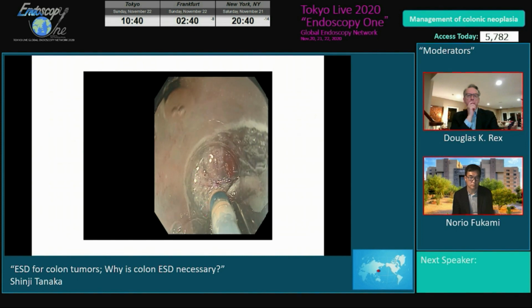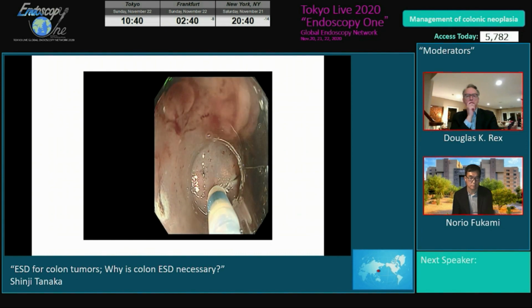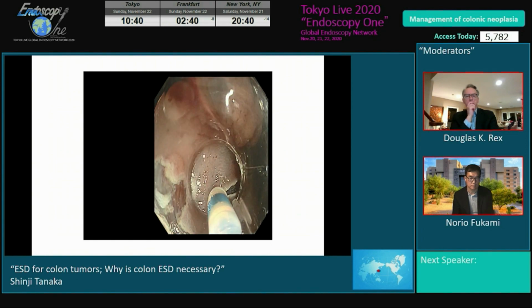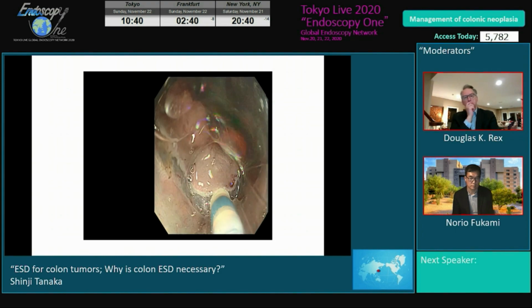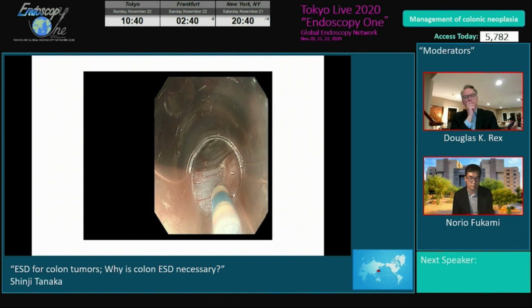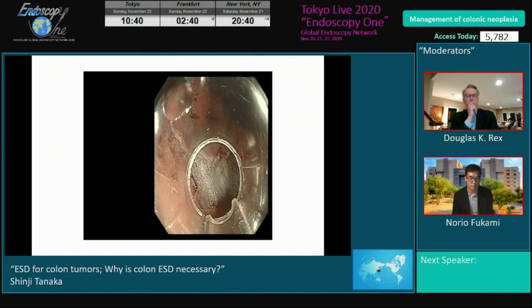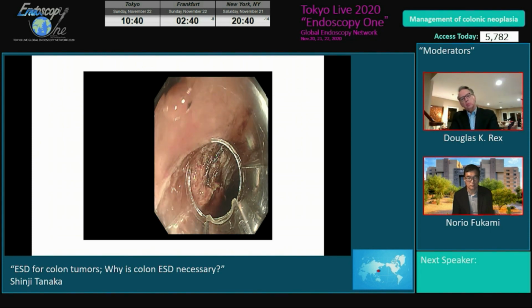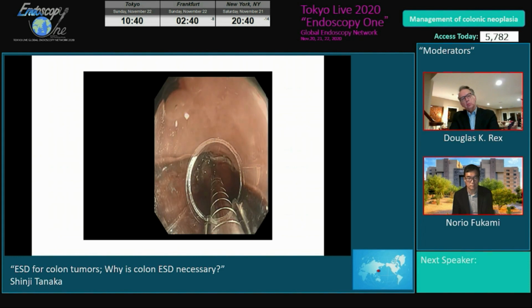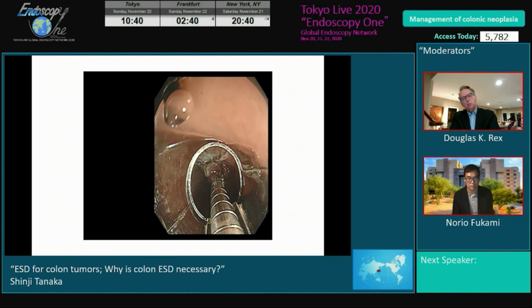To use SO clip, at first we conduct the circumferential normal mucosa incision around the region where there is no fibrosis. After normal mucosa incision, we add submucosal dissection. For this perpendicular approach to muscle layer, dual knife needle technique is useful. Dual knife needling technique should be used under the normal mucosa, not under the region, to avoid the overburning effect.